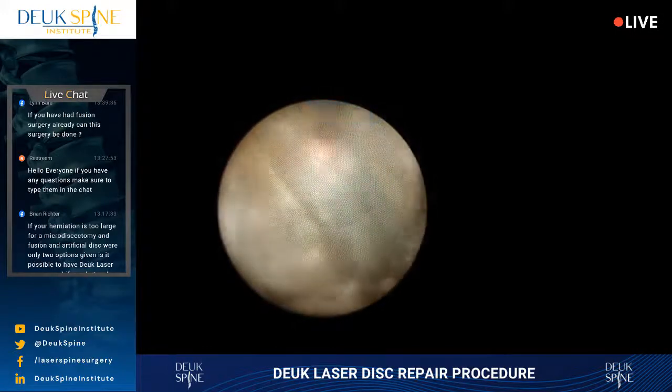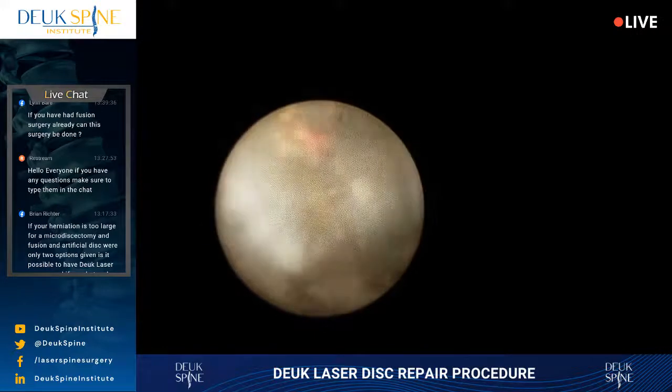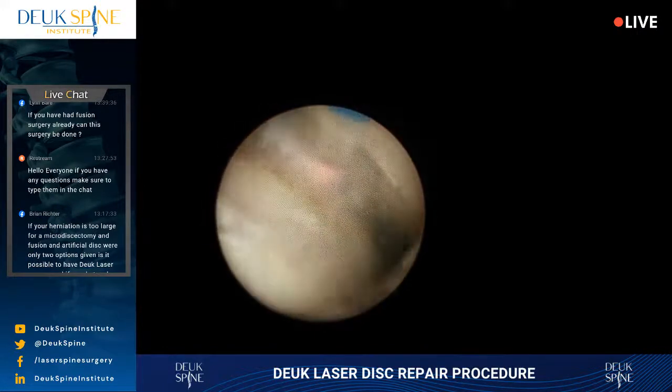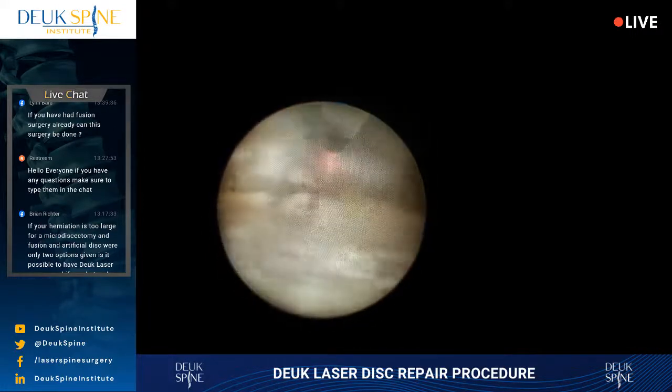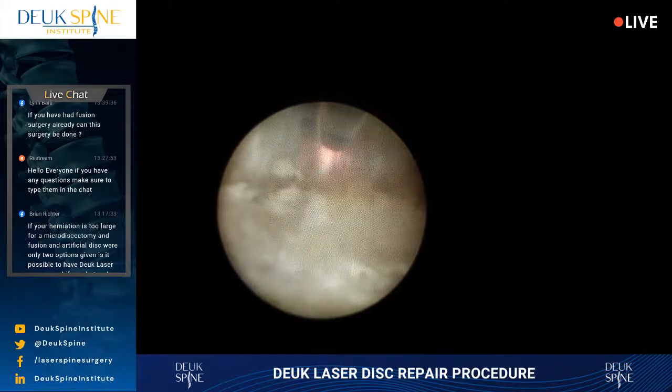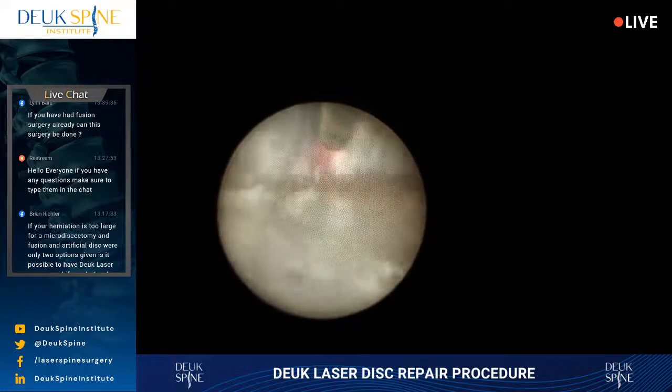This is a fiber optic scope, for those of you who don't know. Fiber optic scopes are not as good in terms of their visualization as is a rod lens scope. But I don't like the rod lens scope because the rod lens scope is too bulky.